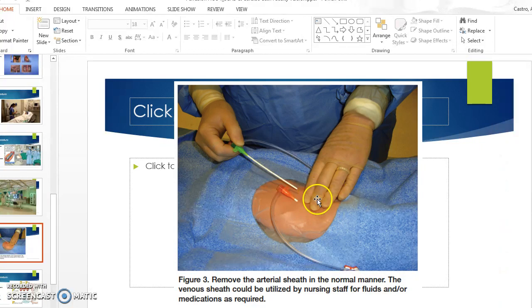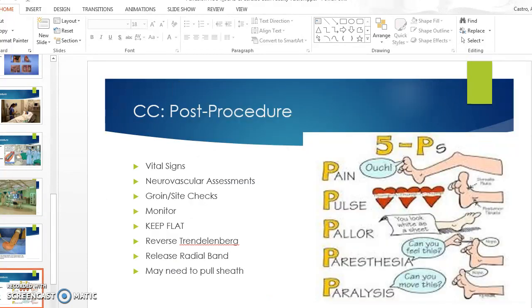So on this one, I guess what I wanted you to see is, do you see how the physician probably poked the patient? If you could see the hole, it's probably right underneath. Probably a she, looks like a nicer ring there. She poked him way down here. So why is she holding up here? Well, if we look at a cross section of the skin here, and we go in at this 45-degree angle, which is called modified Seldinger's technique, the hole in the artery is actually going to be way down here, about an inch. So whenever you have a patient that's bleeding, and you need to hold manual pressure on the femoral artery, you hold about 2 centimeters or an inch above the insertion site because of Seldinger's technique.